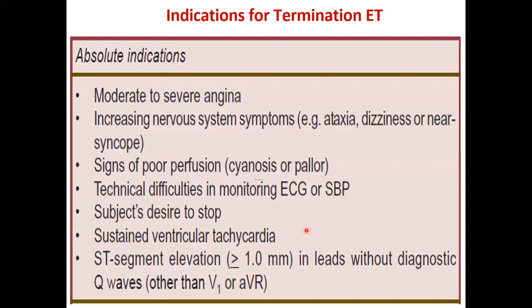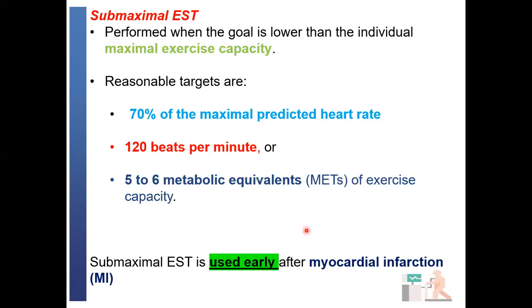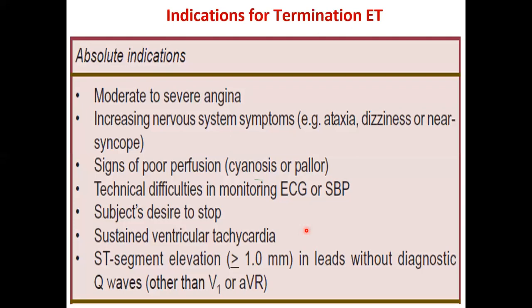So in addition to that, there are other indications. Before then, it's important for me to state here that most of the times we conduct submaximal exercise stress tests. Most of what we do is not the maximal exercise stress test. So, other indications for termination of exercise stress tests: there are some absolute indications.